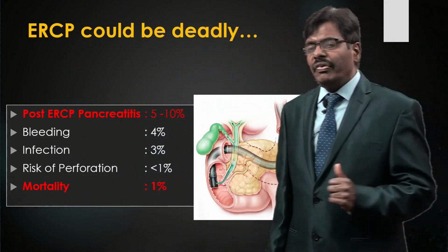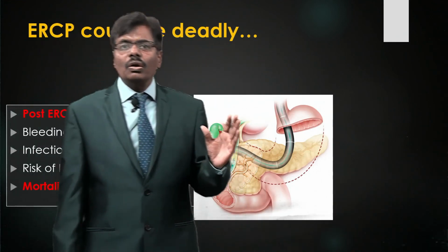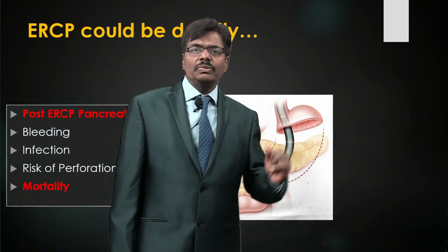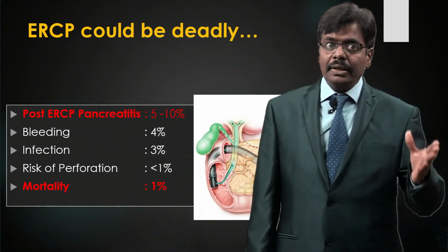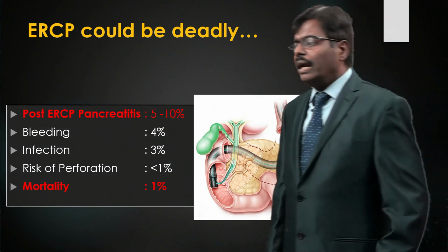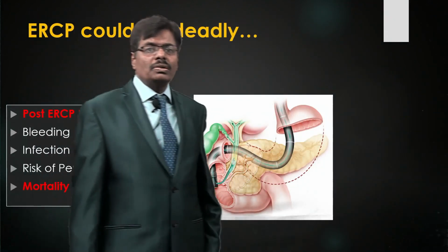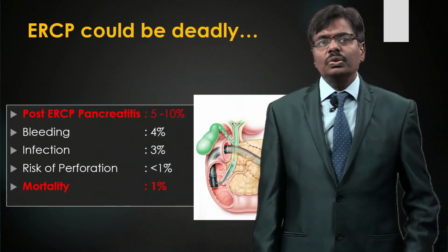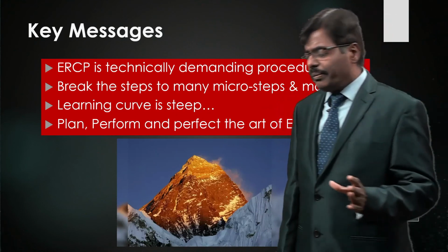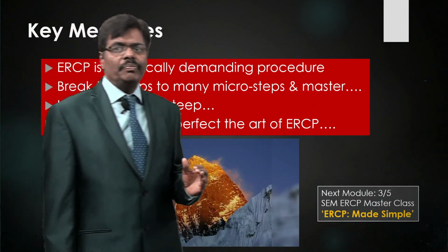Okay, and perforation: if you are careful not to overinflate your balloons, and not overzealous with your sphincterotomy, perforation should not be a problem. But still, pancreatitis or all these complications can give rise to a well known mortality rate of around 1%. That's why it is not without danger, so don't take it lightly. So try to perfect the art, because it is a technically demanding procedure.